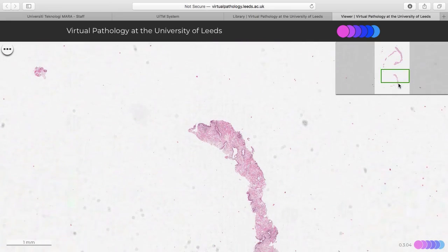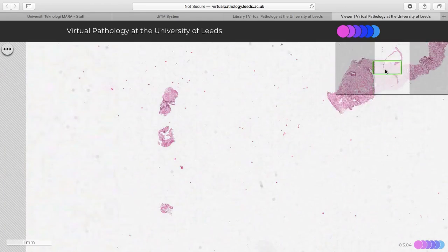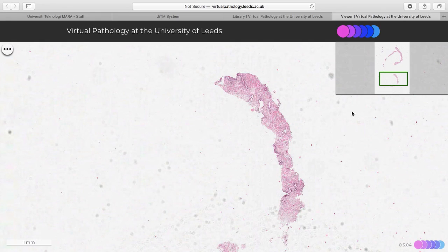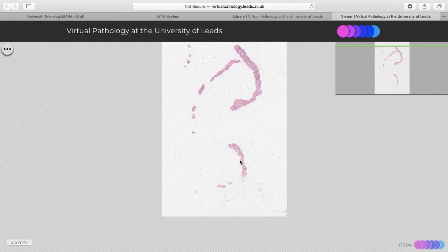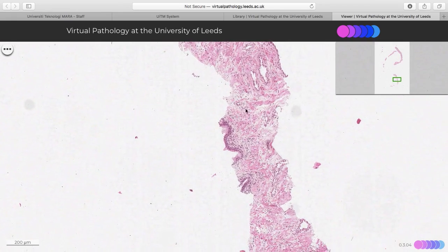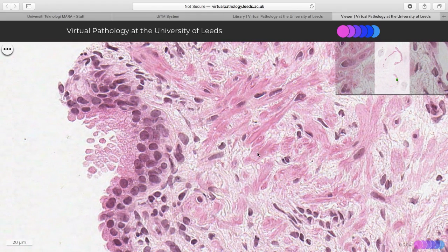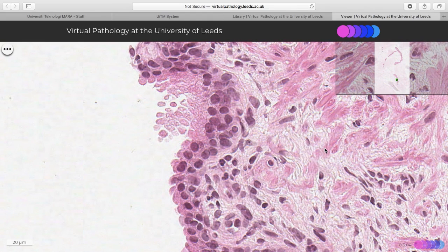If I now move to the bottom core, similarly we have mostly stroma and then the occasional glands here. I just want to focus on the lower part first to illustrate what normal prostatic tissue or prostate glands should look like. The stroma is fibromuscular, so you can see the nuclei of the stroma there, and this is part of a gland.